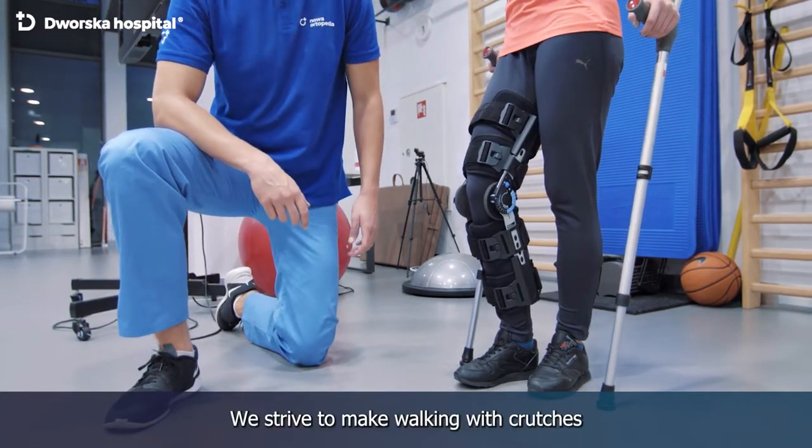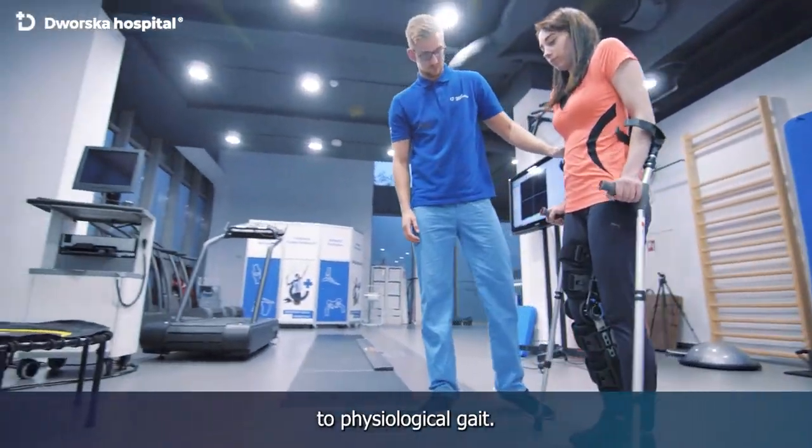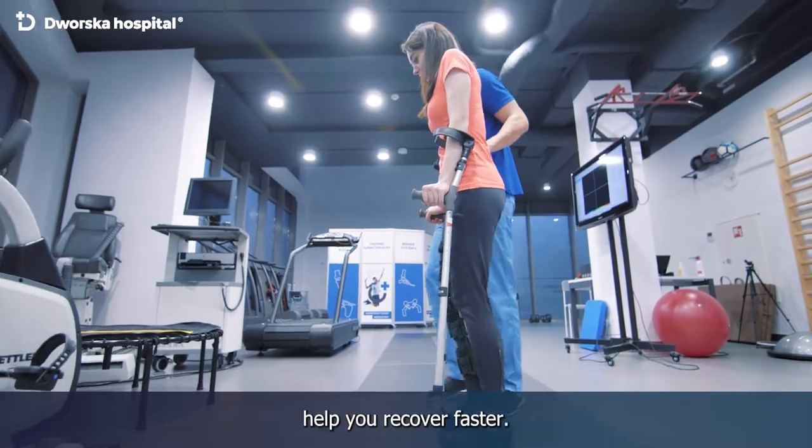We strive to make walking with crutches as similar as possible to physiological gait. This strategy will help you recover faster.